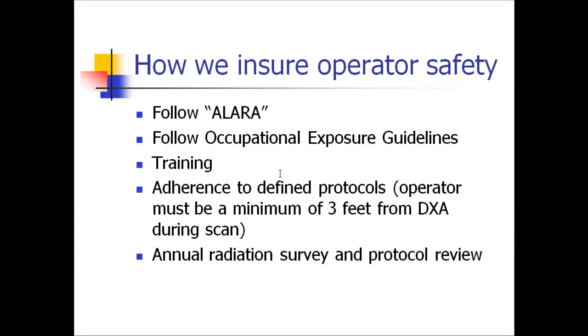Okay, so how do we ensure operator safety? We follow the principle of ALARA, follow the occupational exposure guidelines, as I've just indicated, the training that you're taking now, and adherence to defined protocols. One such protocol is that the operator is typically a minimum of 3 feet from the DXA during the scan. And then annual radiation survey and protocol review, which I'll go over momentarily.